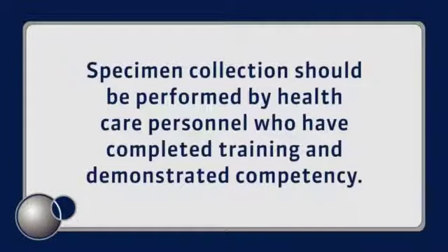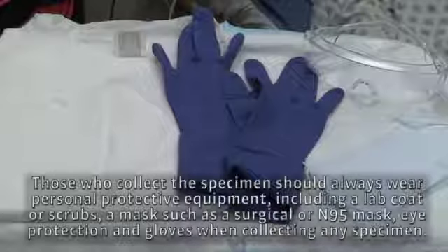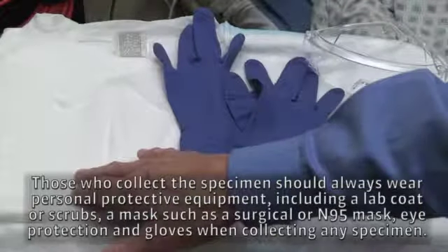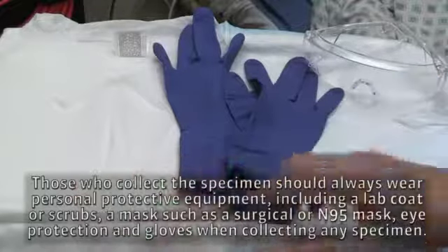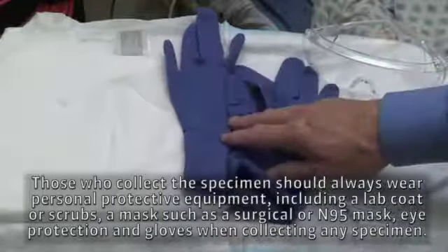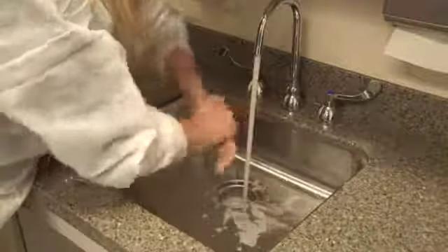Specimen collection should be performed by healthcare personnel who have completed training and demonstrated competency. Always read the manufacturer's package insert for specific instruction regarding specimen collection and transport for the type of test kit being used. Those who collect the specimen should always wear personal protective equipment including a lab coat or scrubs, a mask such as a surgical or N95 mask, eye protection, and gloves when collecting any specimen.